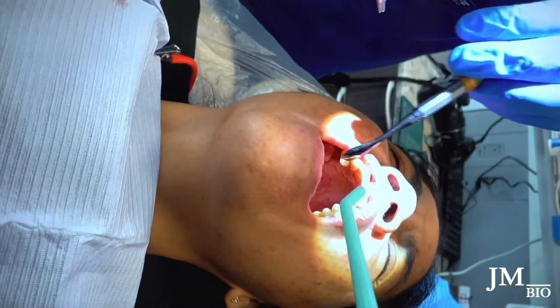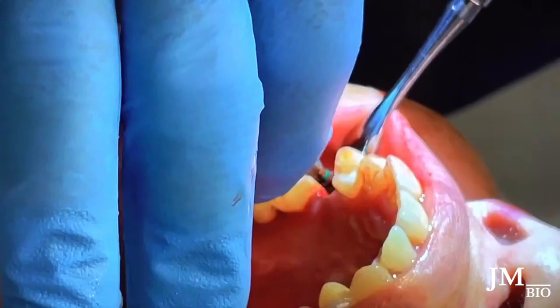There was a little tissue debris, so I'm just cleaning that off, trying to irrigate it off. I try not to touch the implant if I can — I never touch it with my glove. If I need to touch it I use instruments. I hand-drive it in, and once it gets tight enough I pop it off and drive it in with the motor. If it feels super tight, I take it out and enlarge the hole just a little bit bigger.